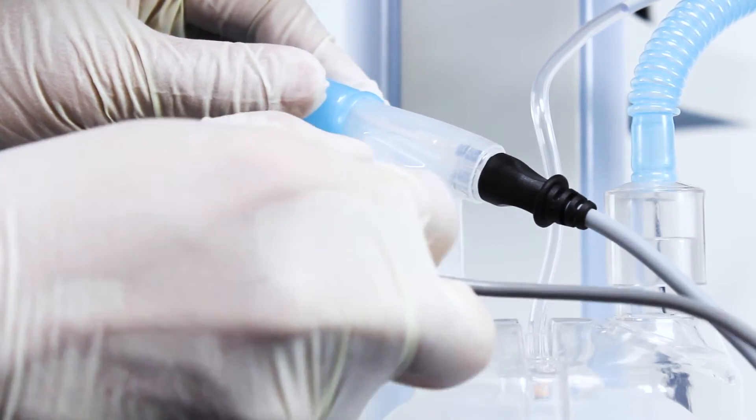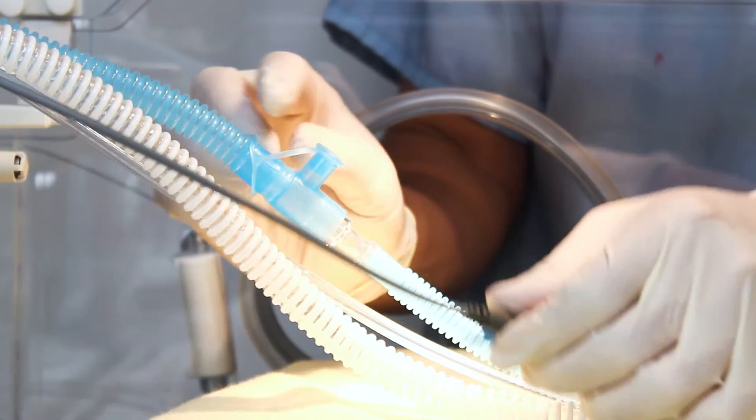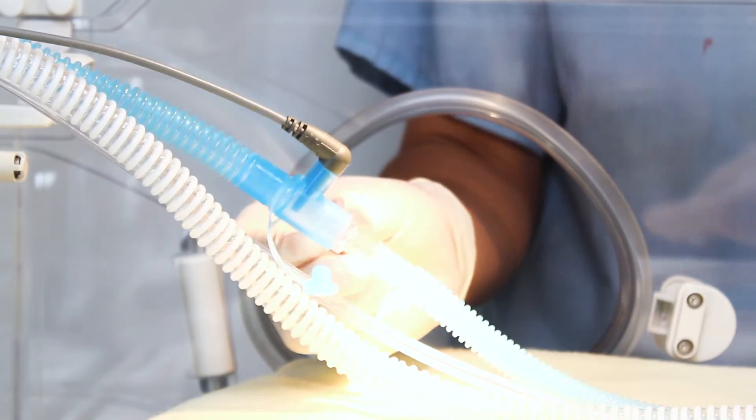The central chamber outlet temperature probe is positioned into the sensor port in the angled elbow of the inspiratory limb. When an incubator is used, such as in this scene, the probe at the end of the lead is inserted into the sensor port at the end of the inspiratory heated wire limb and before the incubator extension.